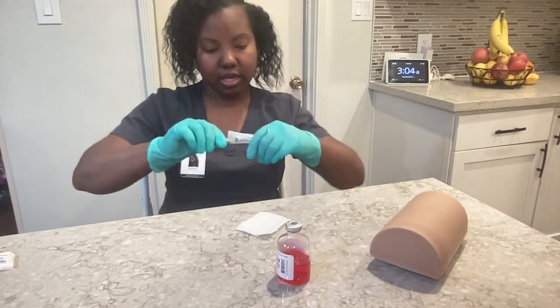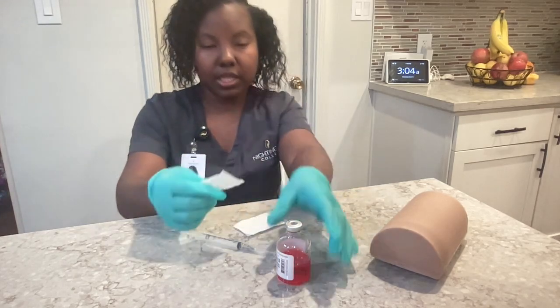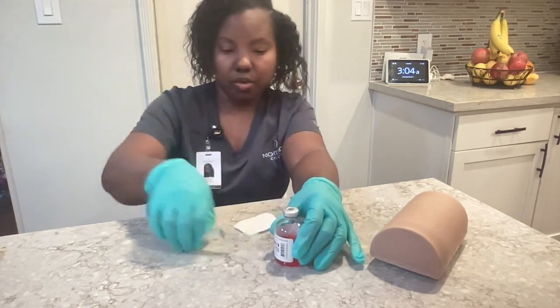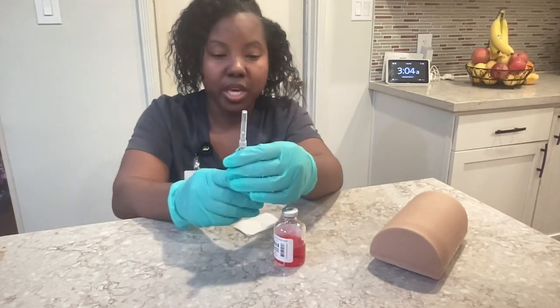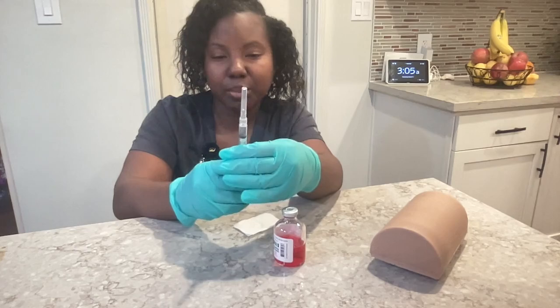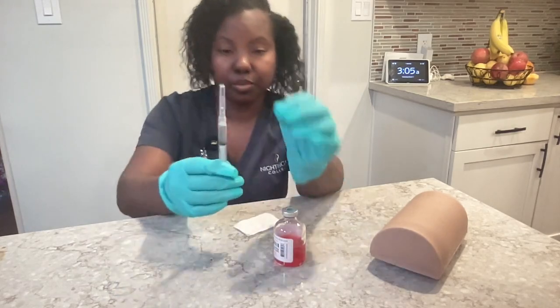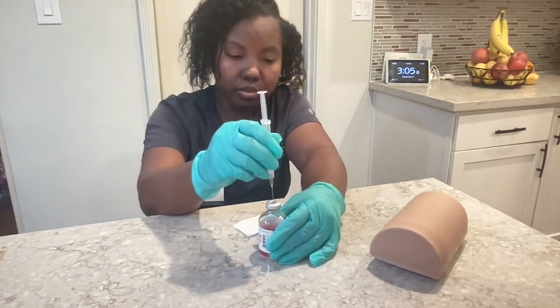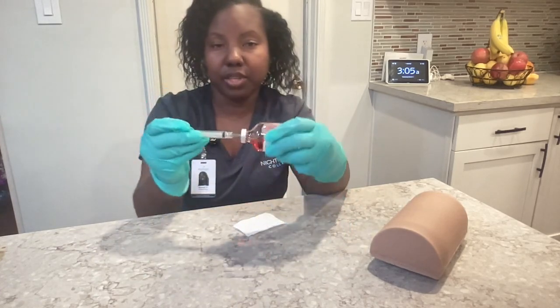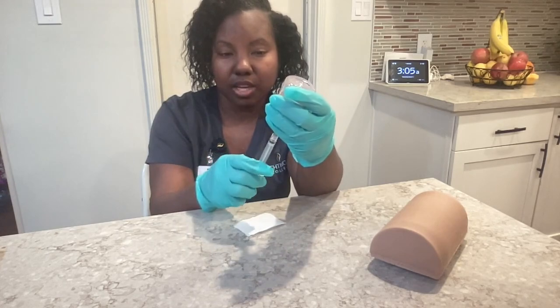I am just connecting the syringe with the needle. I will clean the top of the medication valve. Since I will be withdrawing 1.5 milliliters out of the medication valve, I need to put in 1.5 milliliters of air into the medication valve. I will put in the air, then invert and withdraw 1.5 milliliters of the morphine.